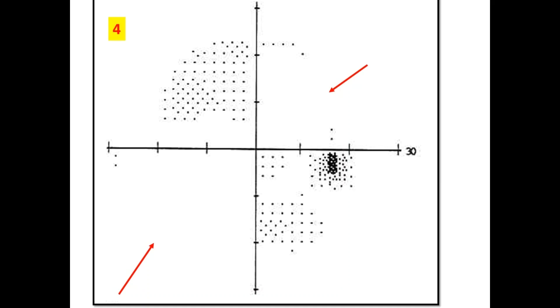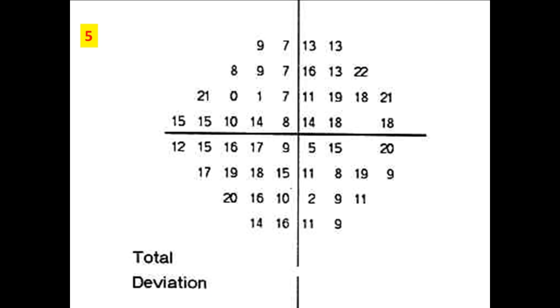The grayscale shows white scotomas, which are patches of abnormally light or entire areas of white tones. The total deviation numeric plot shows high false positive deviation from age-matched normal subjects.